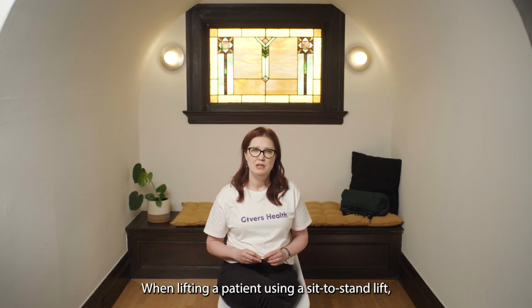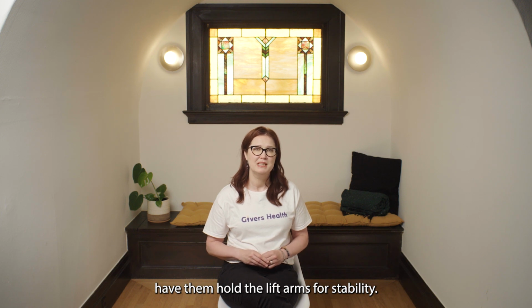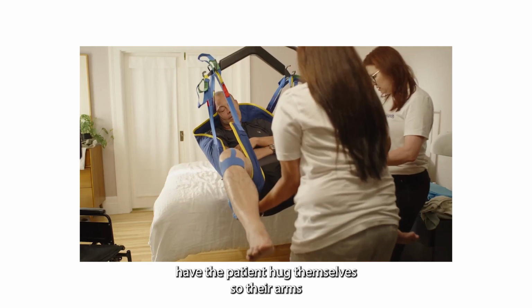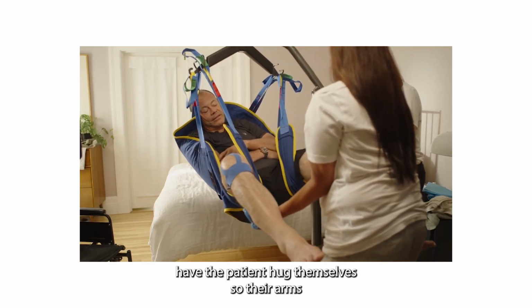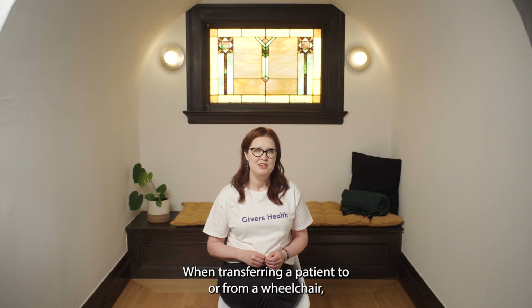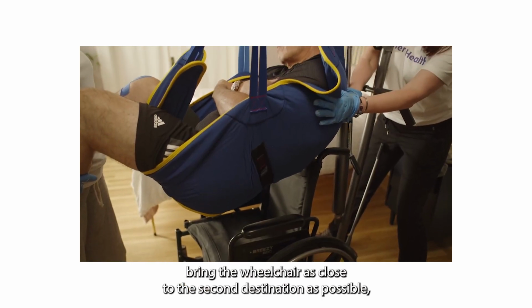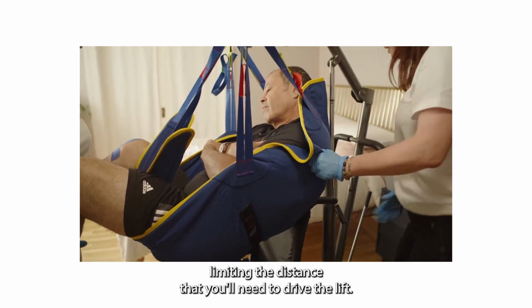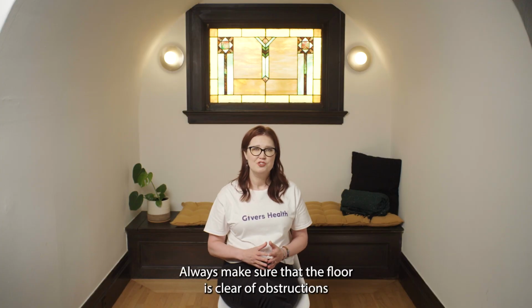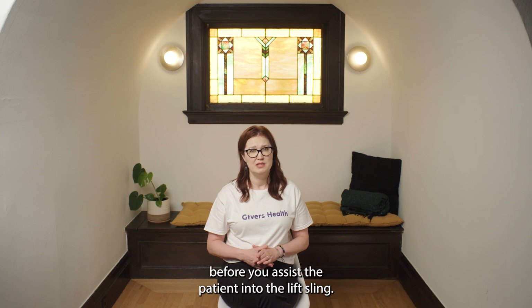When lifting a patient using a sit-to-stand lift, have them hold the lift arms for stability. When lifting a patient using a mechanical lift, have the patient hug themselves so their arms remain safely out of the way of the lift. When transferring a patient to or from a wheelchair, bring the wheelchair as close to the second destination as possible, limiting the distance that you'll need to drive the lift. Always make sure that the floor is clear of obstructions before you assist the patient into the lift sling.